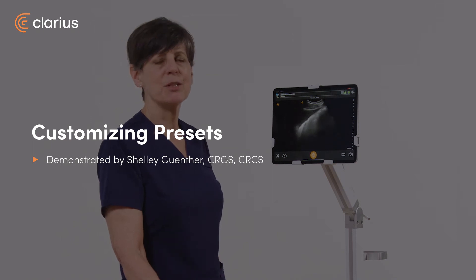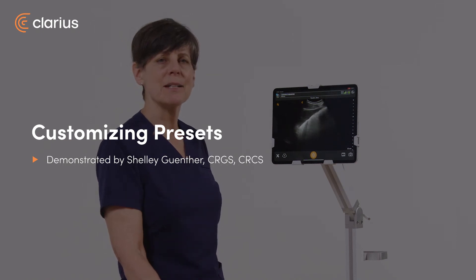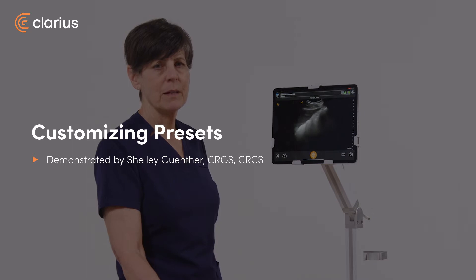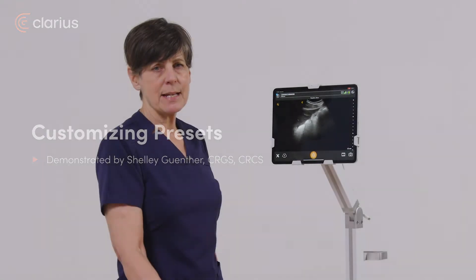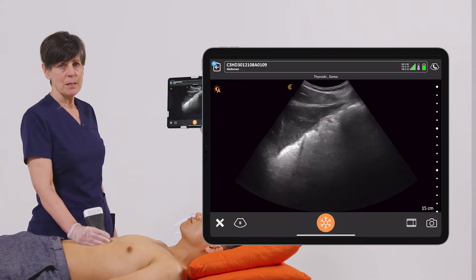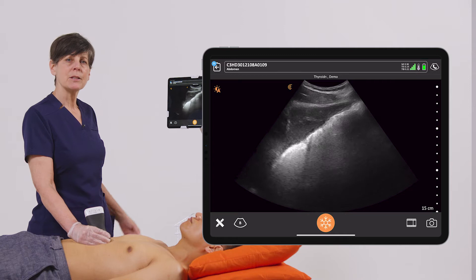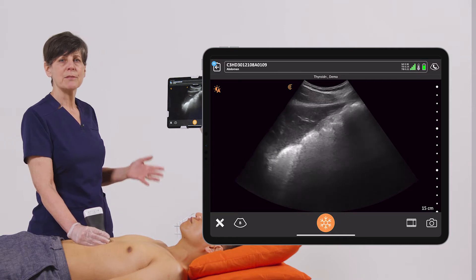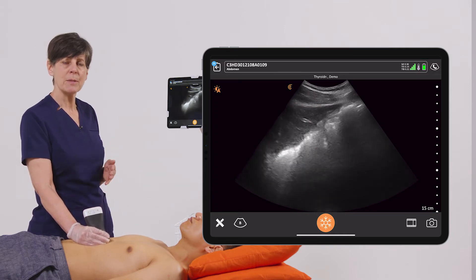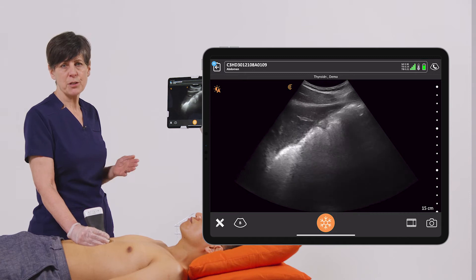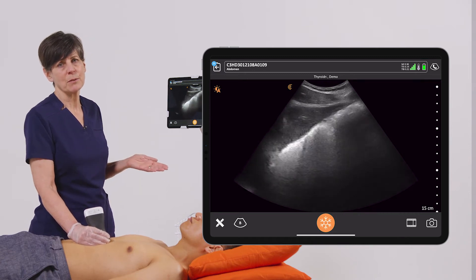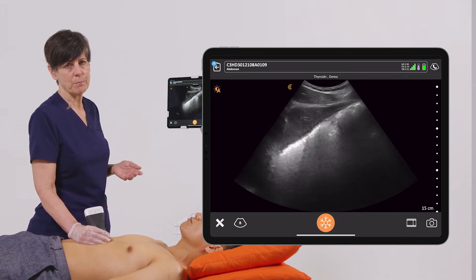Hi, my name is Shelly, and I'm going to show you how you can customize presets with your Clarius scanner. Clarius has multiple scanners for multiple applications, but sometimes you like a little bit different look to your image. So I'm going to show you how you can customize each preset for future use so that there's less fussing around when you actually begin to do your scan.